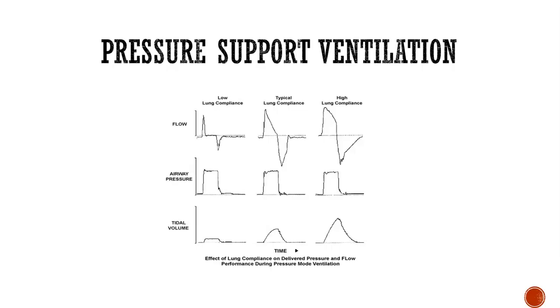With this mode, it gives the patient more freedom with breathing. When the ventilator senses an inspiratory breath, dependent on the trigger sensitivity that's been set, it responds by delivering a gas flow with raises in the pressure in the airways. This has been shown to reduce the work of breathing and oxygen consumption, so it's become a highly useful adjunct, particularly in stable vent patients.